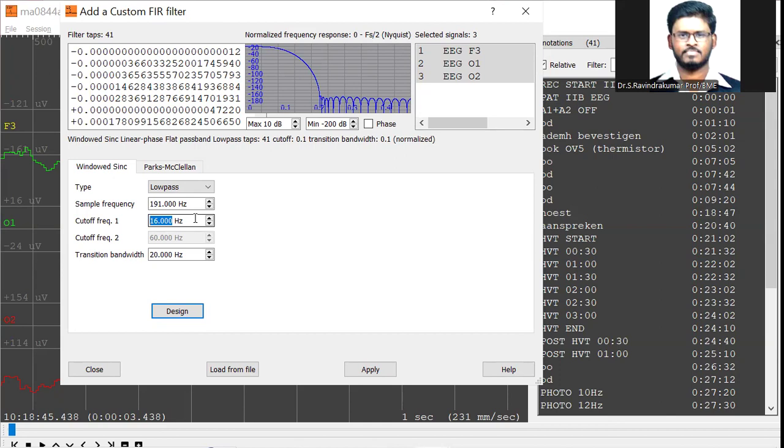Sometimes we can have an integrated analysis. For example, the EEG signal will be kept here, and we will have the MRI. For example, if we go with a signal like functional MRI, the cognitive functions, especially for students, children suffering from dyslexia, those students will have those issues. Or for example, if a patient is having a problem with Parkinson's disease.